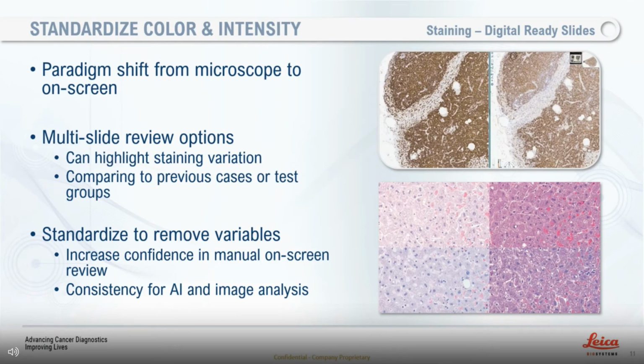The next step in the process that I'd like to speak to in relation to digital ready slides is actually around the staining. Whether this is your H&E staining, your standard routine staining, special stains, IHC, or other staining modalities, moving from reading slides on a microscope to reading on screen is a paradigm shift for the reviewer, whether that's a pathologist, laboratory personnel, or researchers.